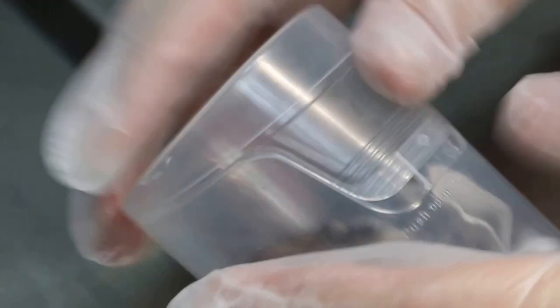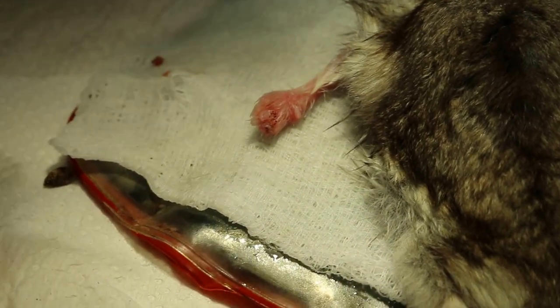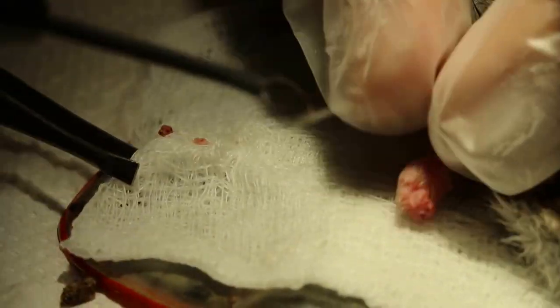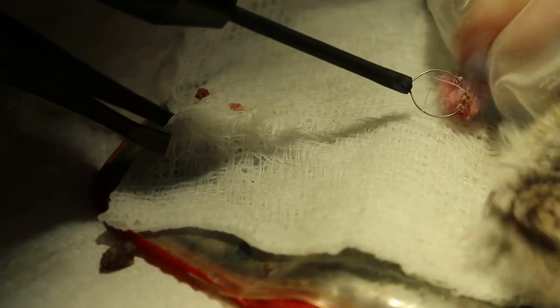Unfortunately, hamster, you can't tell the exact dosage. So okay, I shall be finishing soon. Part of it has been off already, has been burned off. Electro-surgery, okay, one more. Then I use my hand. Okay, it's finished.